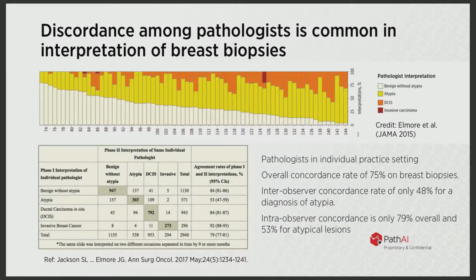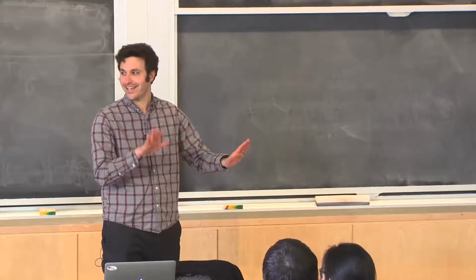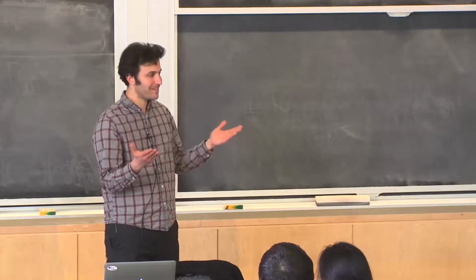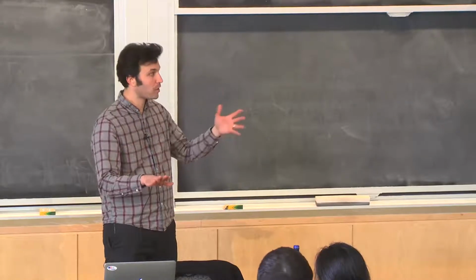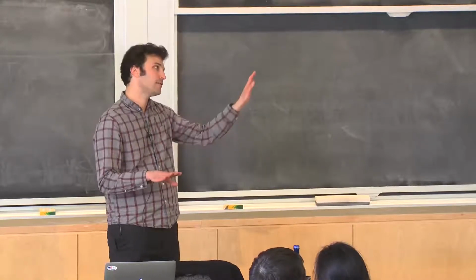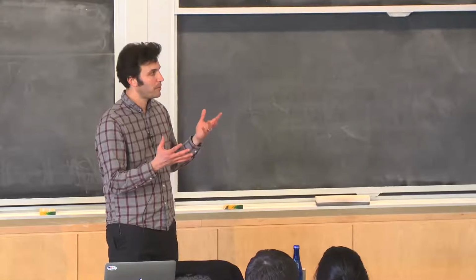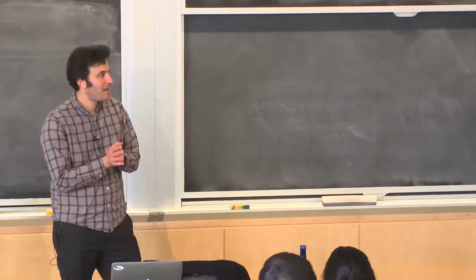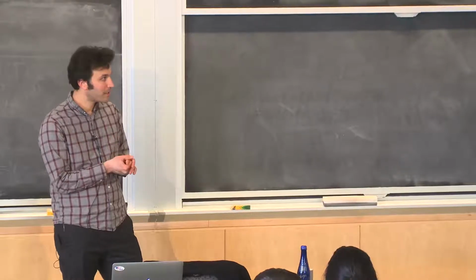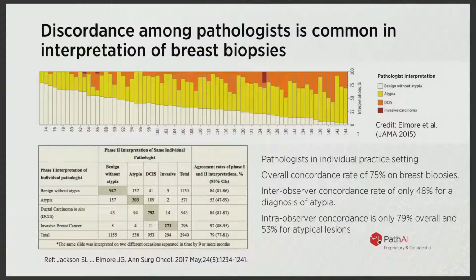What does atypical mean? Yeah, so atypical is this border area between totally normal and cancer, and it is actually the most important diagnosis, because totally normal, you do nothing. Cancer, there are well-described protocols for what to do. Atypia, they often overtreat, and that's the bias in medicine, to always assume the worst when you get a certain diagnosis back. So atypia has nuclear features of cancer, but doesn't fully meet the criteria, maybe 7 of the 10 criteria or 3 of the 5 criteria. And it has to do with nuclei looking a little bigger and a little weirder than expected, but not enough where the pathologist feels comfortable calling it cancer. And that's part of the reason that shows almost a coin flip. Of the ones the experts called atypia, only 48% was agreed with in the community.